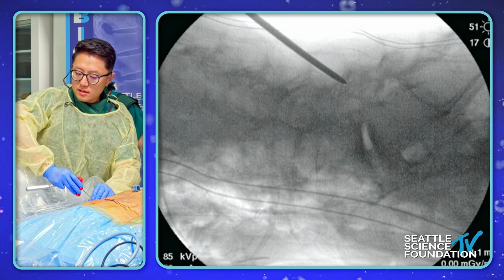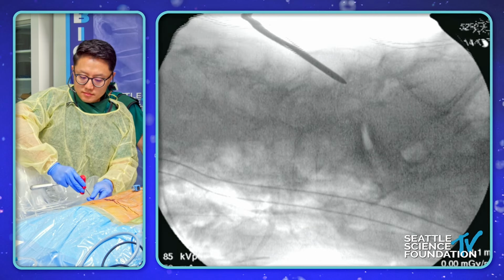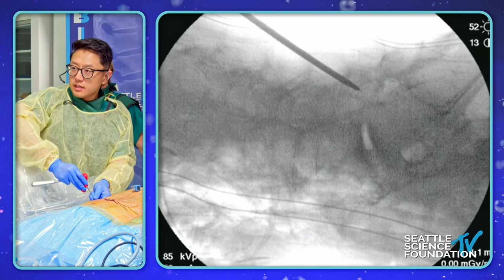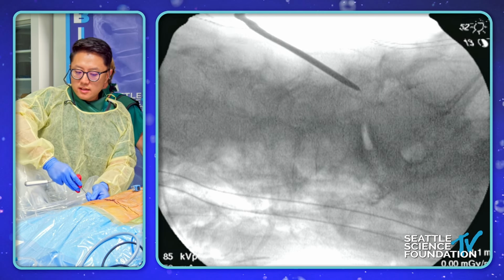You can faintly make out the foramen here, the arch, and this is coming up from pedicle to SAP right here. Yeah, it's still a little bit hard to tell, but much better. Shot there. So, Meng, you want to share with us what's going on in your head right now? Because in your head, you're right now triangulating.